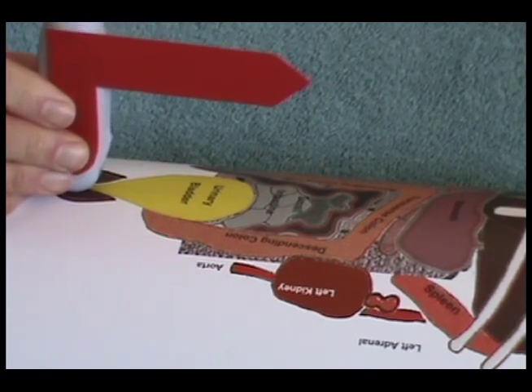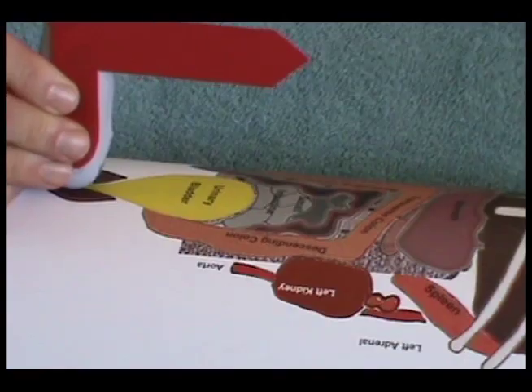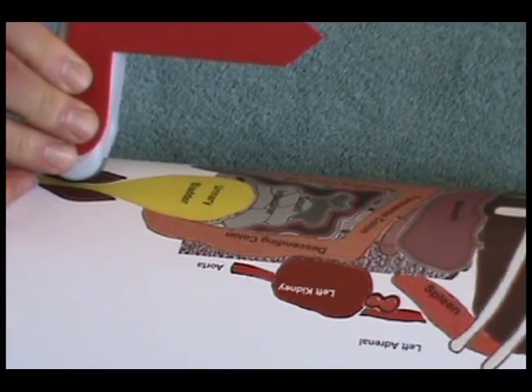Fan the transducer to the patient's right side, then reverse and fan to the patient's left side till you have seen all of the prostate tissue.